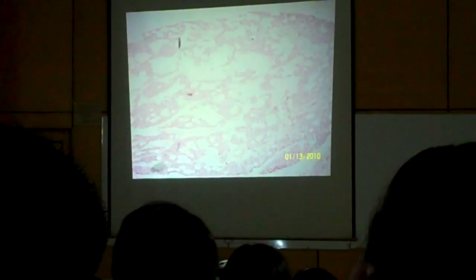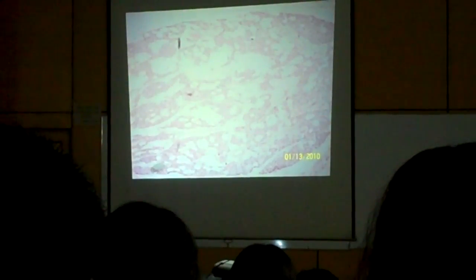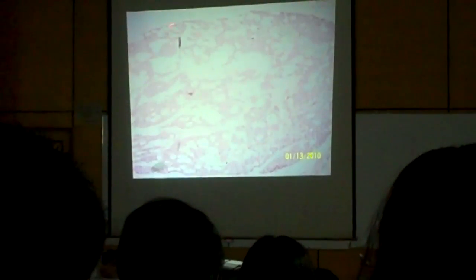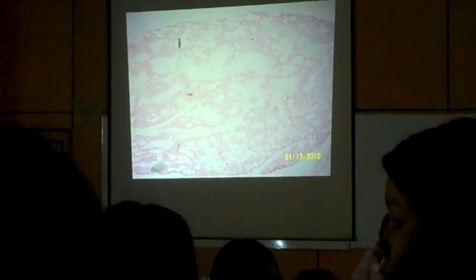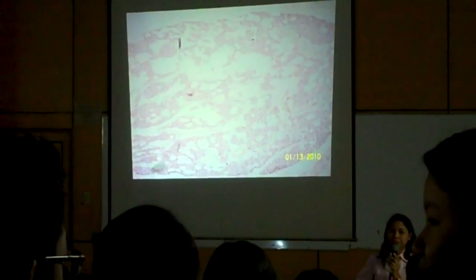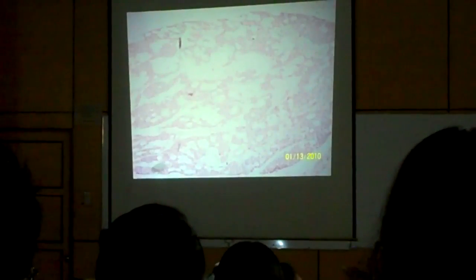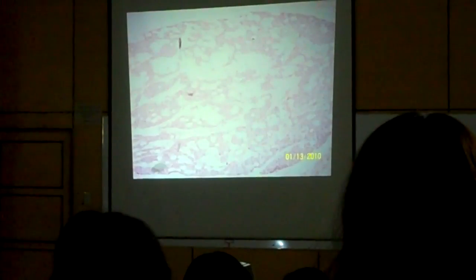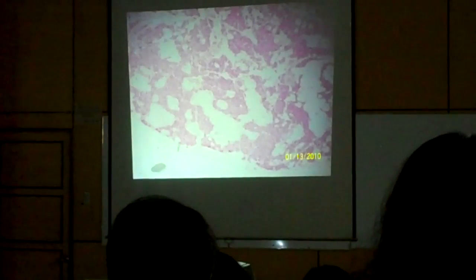Okay, next organ. Identify the entire structure, the entire organ. So this is not just part of the organ, but actually the entire organ. It's small. What do you think it is? Again, parathyroid. This is the parathyroid. You have spaces in between; those are just fatty tissue insinuating between the lobules of the parathyroid parenchyma.